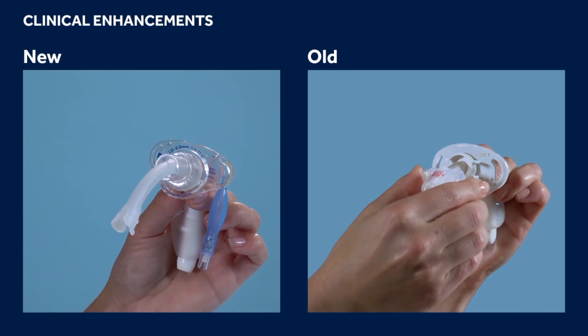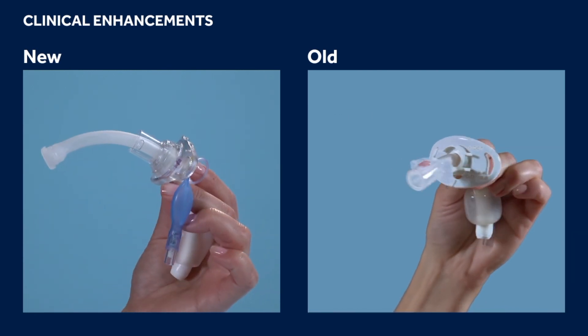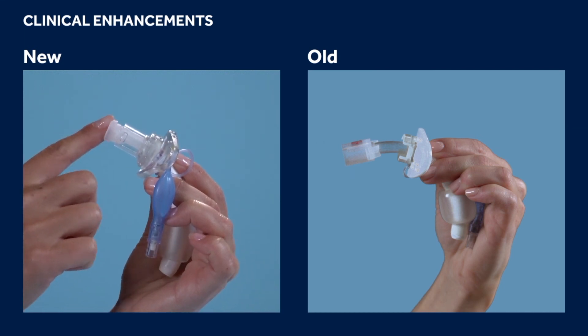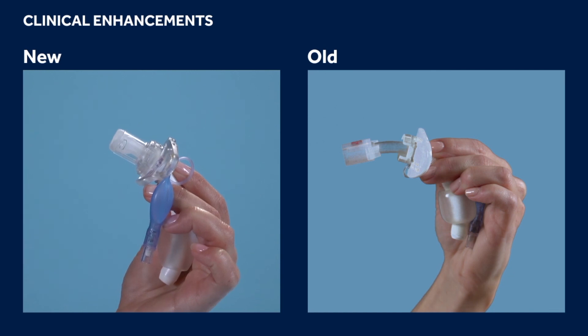As a safety precaution, the inner cannula should always be in place when using a dual cannula tracheostomy tube. In the event of an occlusion, you can simply remove the inner cannula and clear the occlusion rather than removing and replacing the whole device. The Shiley Flexible inner cannulas snap into the integrated connector.